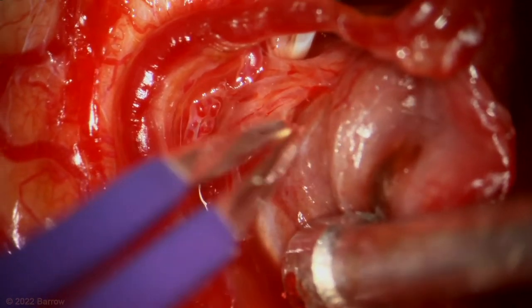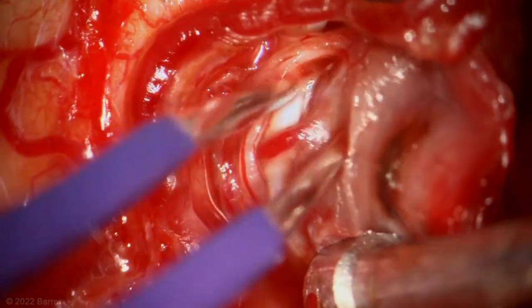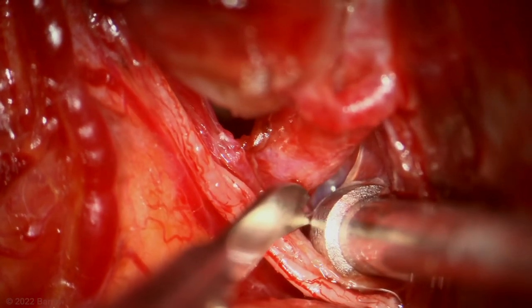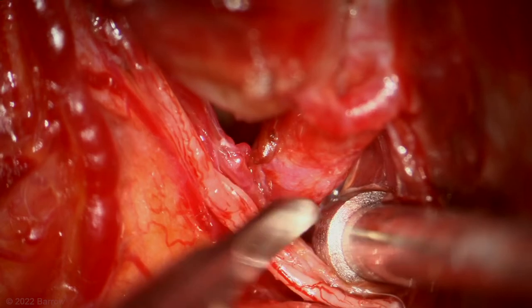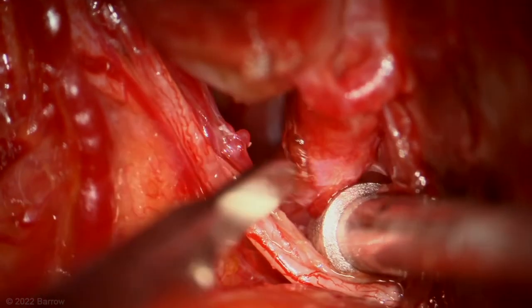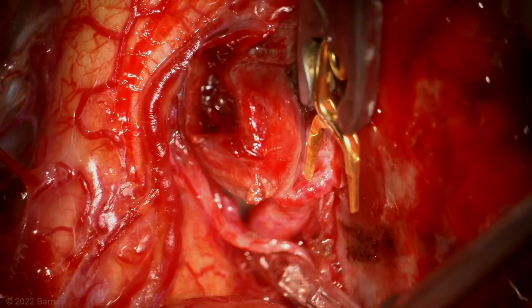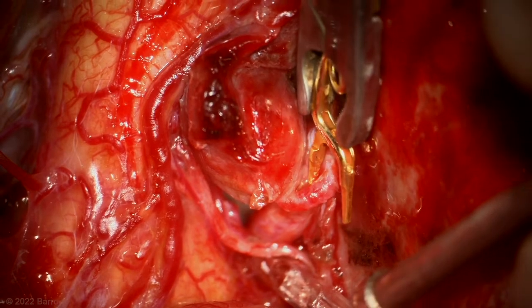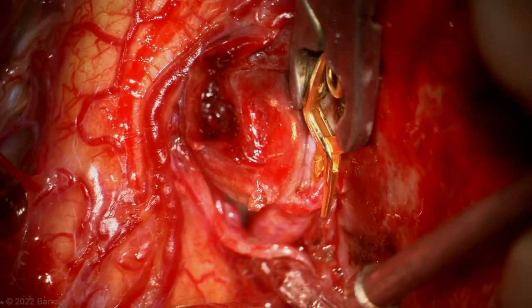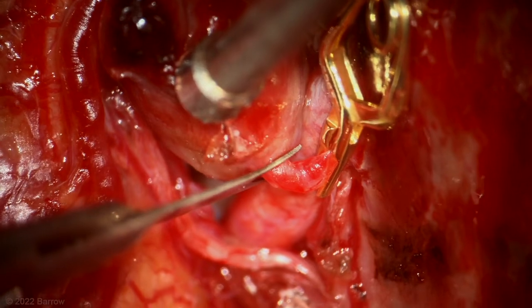Here, the V4 segment is brought into view. This is the site of re-implantation later. First, an attempt was made to try and salvage the proximal PICA as a donor stump.